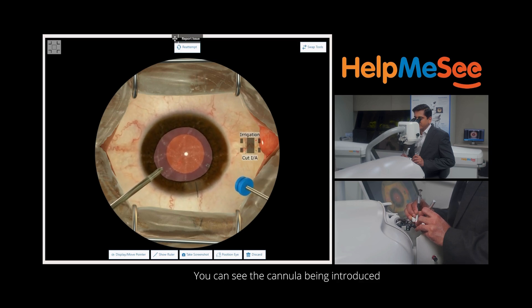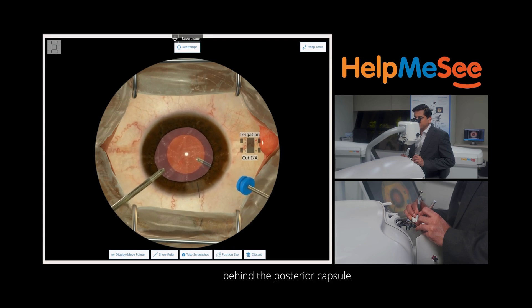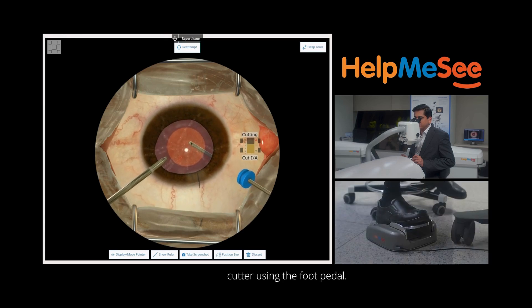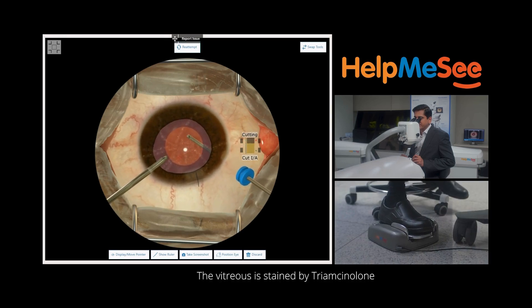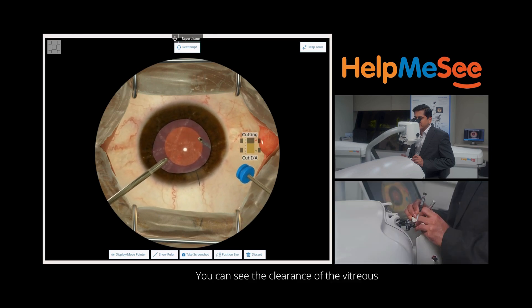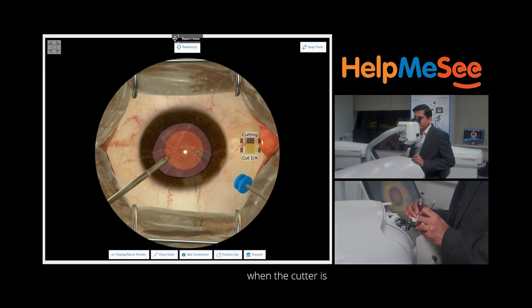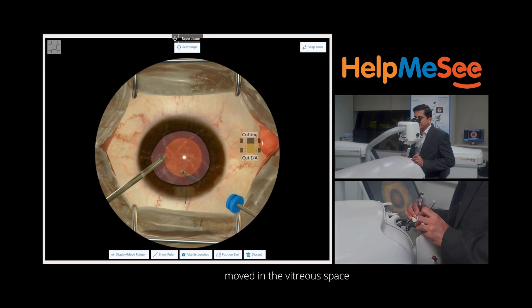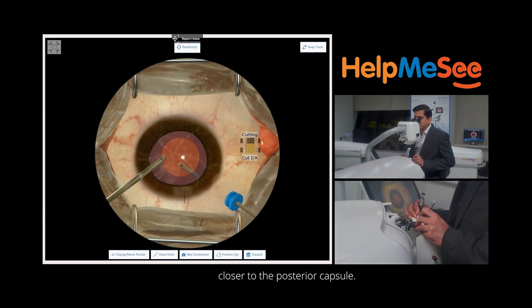You can see the cannula being introduced and visualize it behind the posterior capsule in the Berger space. We start the vitrectomy cutter using the foot pedal. The vitreous is stained by triamcinolone acetonide that's why it is whitish in color. You can see the clearance of the vitreous when the cutter is moved in the vitreous space closer to the posterior capsule.